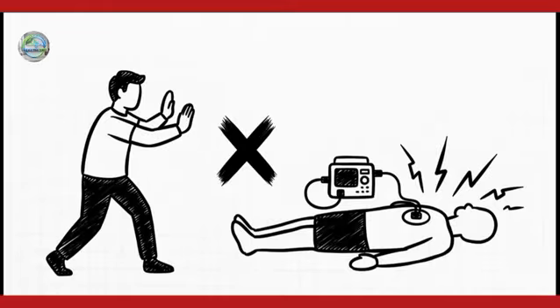When that machine yells, "clear," you have to completely stop your compressions and step back. Do not touch the patient. Why? Well, if you're touching them while it analyzes, the machine might accidentally pick up your heartbeat instead of the victim's. And far worse, if you're touching them when it delivers a shock, you're going to get shocked too, which could send your own heart into a deadly rhythm.